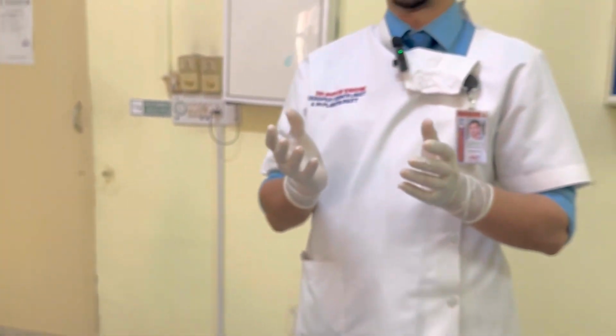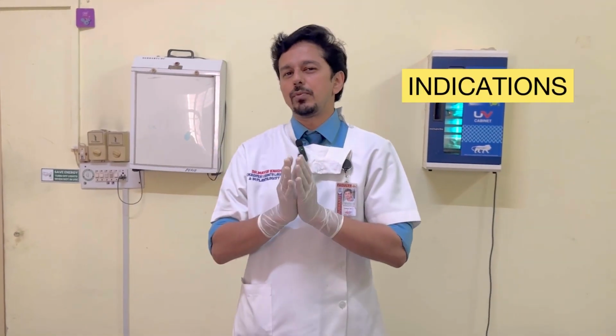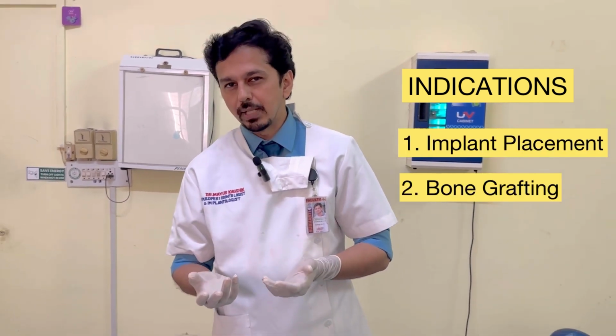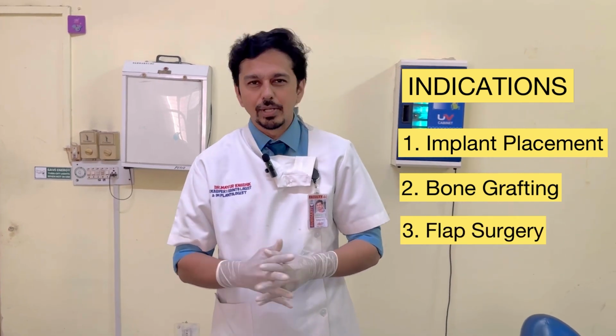Whenever I am talking about incision with a blade, this is the conventionally used method. This would be used wherever I need access to bone. I have to place multiple implants, I have to do bone grafting, I have to do a normal flap surgery for correction of periodontitis. I will be using a scalpel because I need access to bone.